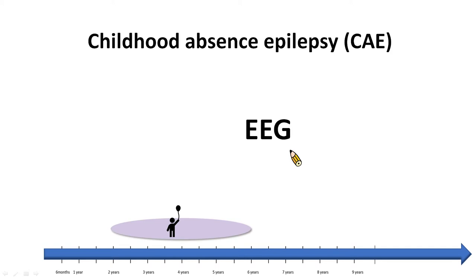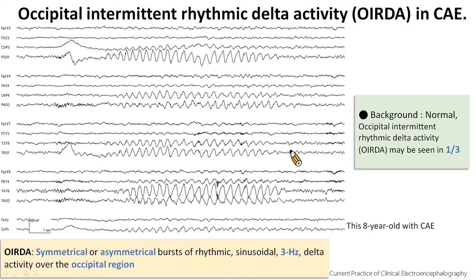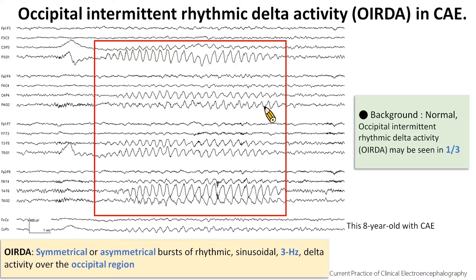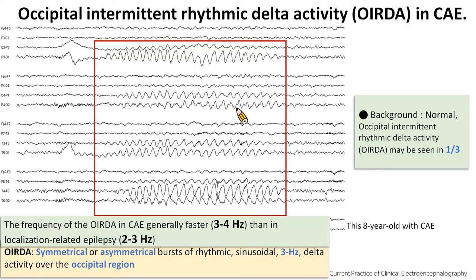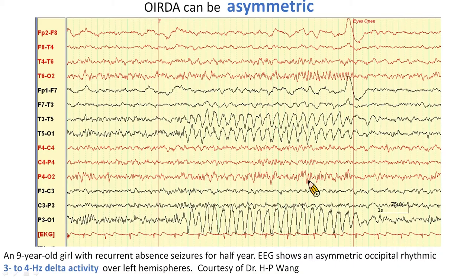Let's take a look at the EEG of childhood absence epilepsy. The background is usually normal. Occipital Intermittent Rhythmic Delta Activity (OIRDA) may be seen in one-third of cases, as highlighted in the red box — there are symmetric bursts of rhythmic sinusoidal delta activity over the bilateral occipital region. Studies show that the frequency of OIRDA in CAE is generally faster, about 3 to 4 Hz, than in localization-related epilepsy, which is about 2 to 3 Hz. OIRDA can be asymmetric in some patients, as shown here over the left occipital region.